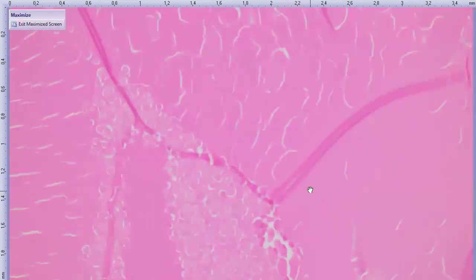And then if we keep heading backwards, here is our posterior portion of the lens capsule. The lens capsule here gets thin, and we can see that there's lens epithelium that has posteriorly migrated, which is another cataract degeneration form. And again, more cataractous features in the back of the lens.